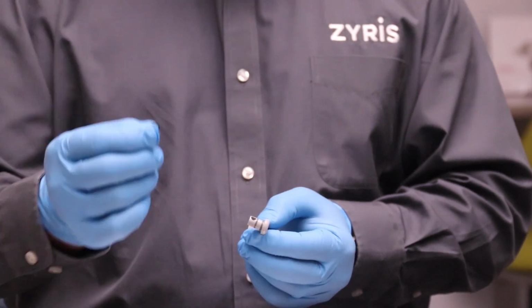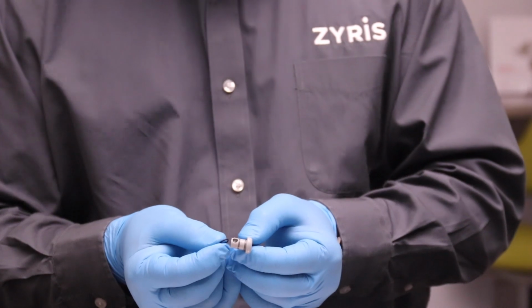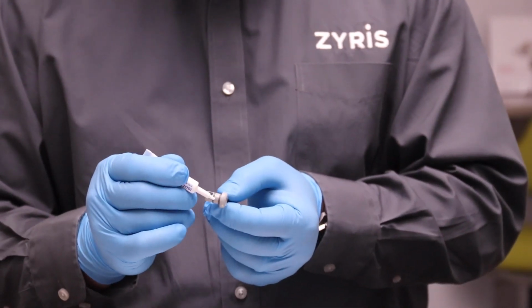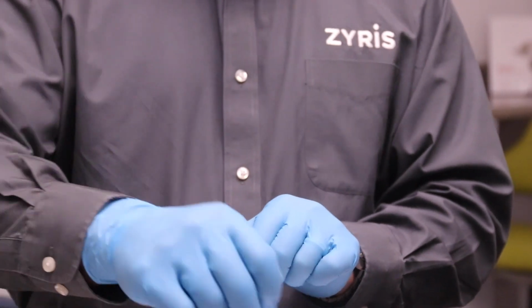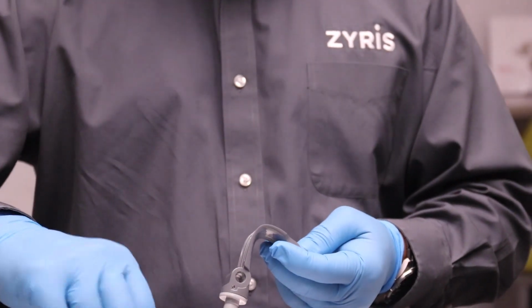If they are not, the included O-ring kit enables you to remove the compromised O-ring and put a new O-ring in place. About once a week or more, if you use the control heads a lot, put some of the Isolite lubricant onto the actual O-rings to ensure that they're supple.